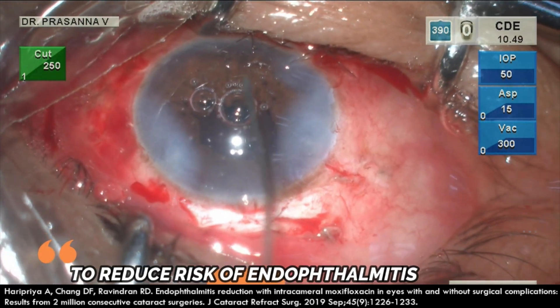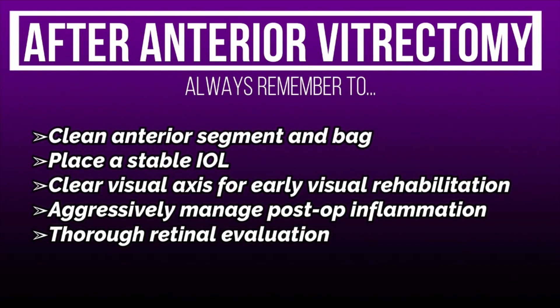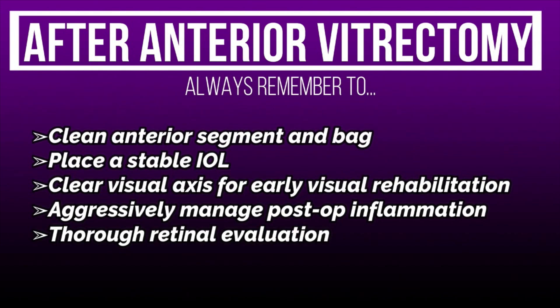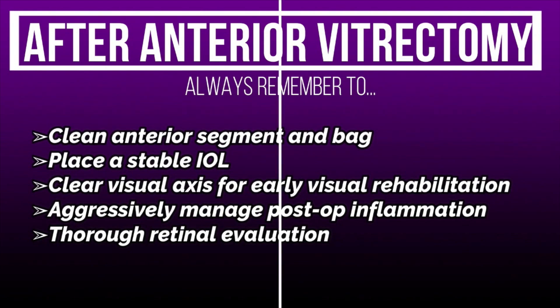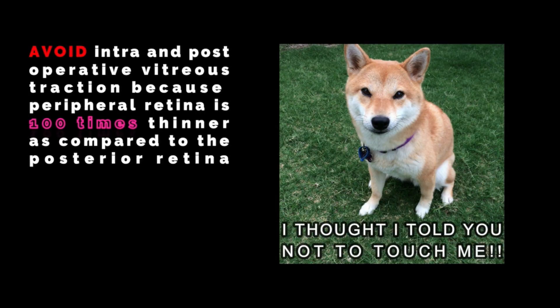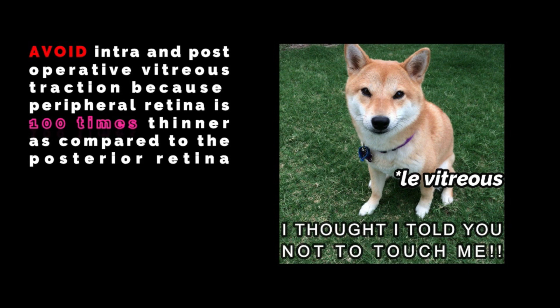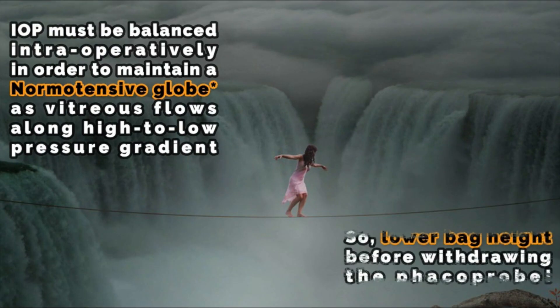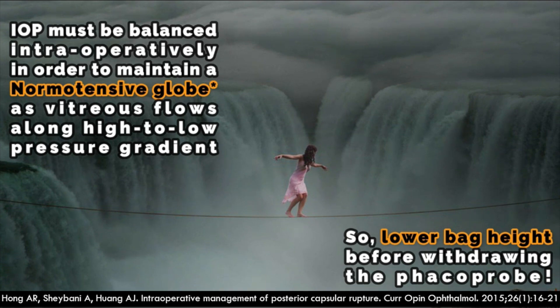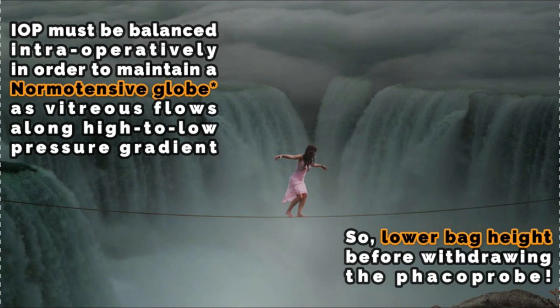Anterior vitrectomy does not stop at the operating theater — the aftercare is of paramount importance to recognize and treat complications. To conclude, remember to handle vitreous carefully. Watch for anterior chamber stability throughout the surgery to contain the complication. We hope we have highlighted the basic principles and simplified the anterior vitrectomy procedure.